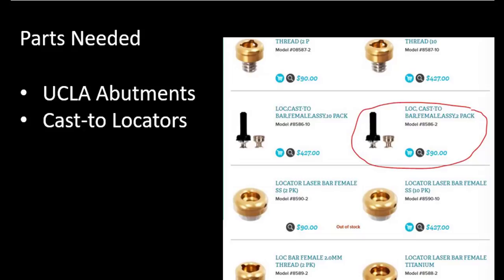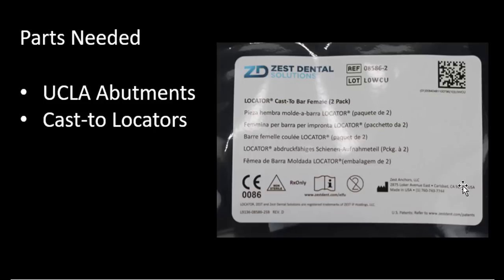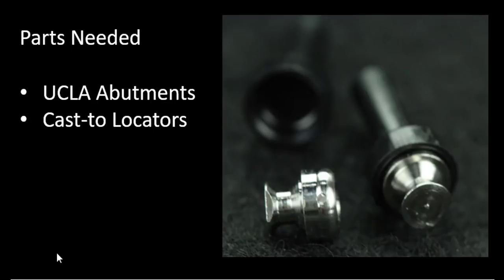They come mounted on a little handle, and as you can see, well, here's the package of those. This is how they come in a 2-pack for $90, so basically $45 a piece. And if you look at these closely, you can see that right here, this is a little retentive portion. This is going to get embedded in your wax pattern so that when they do the burnout, this is going to get filled with metal back into this area, and that's what will embed this into the final bar.